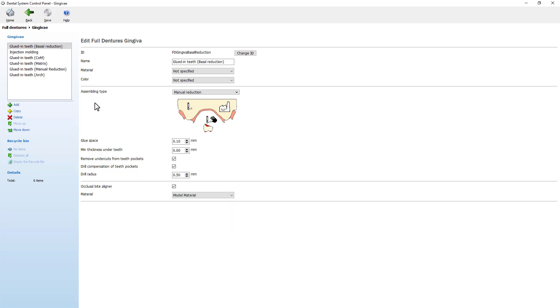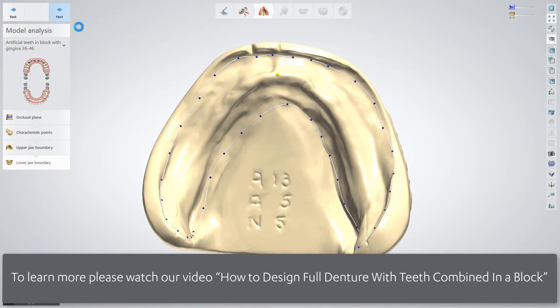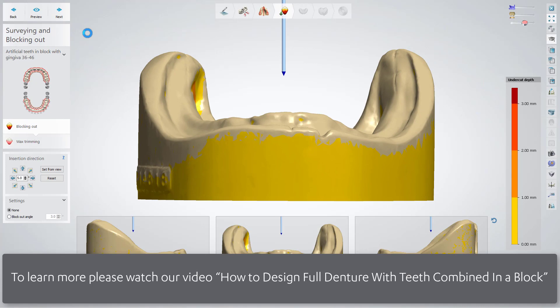Now you can save the changes and start designing a full denture in the usual manner. If you want to see more and learn how to design a full denture with teeth combined in block, please watch our video.